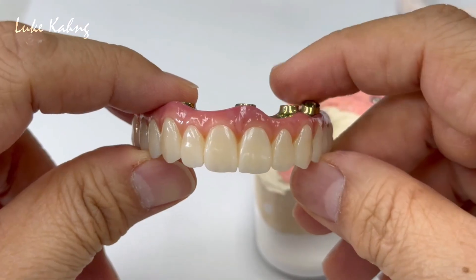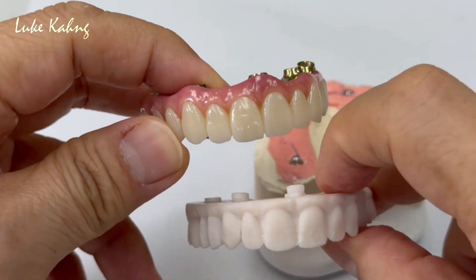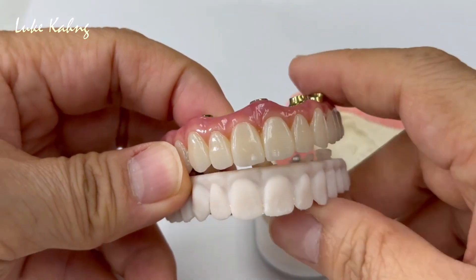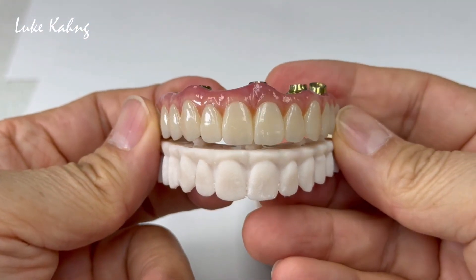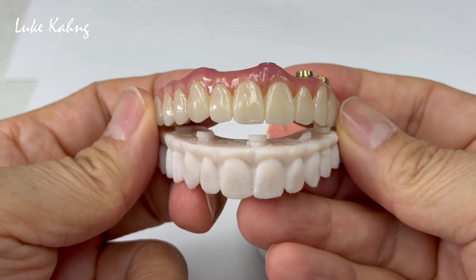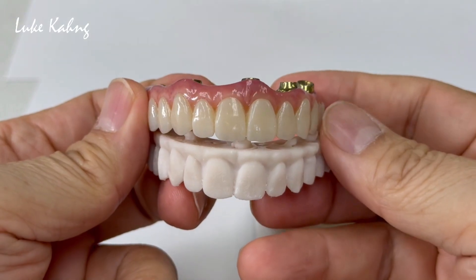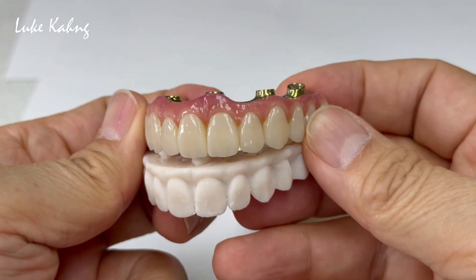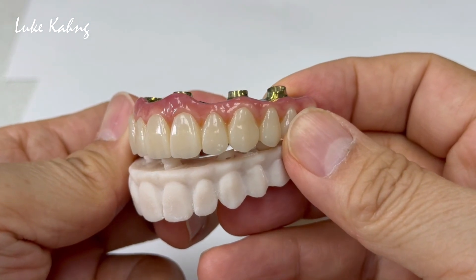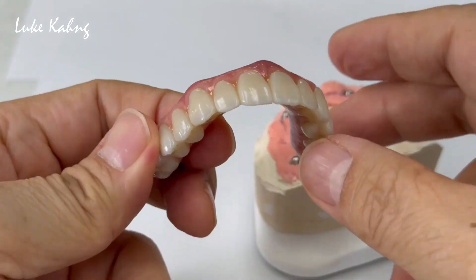Now we're debating the color, shape, and contour for these patients. We can make better aesthetics — more natural, lifelike restorations, not like bleaching. Some people want bleaching, some people don't. Maybe a little more character — real-life teeth with surface texture and symmetry too. Now we're going to cement.